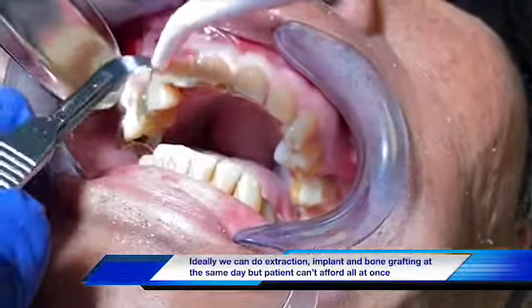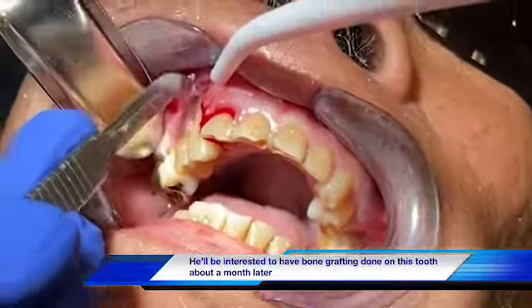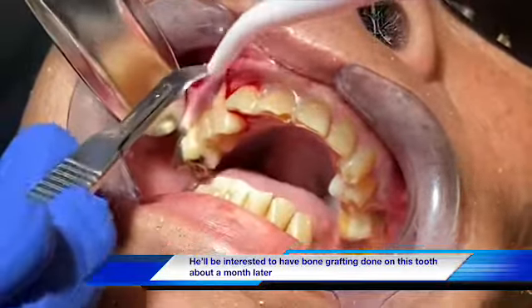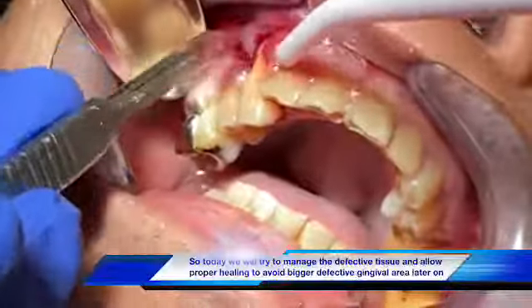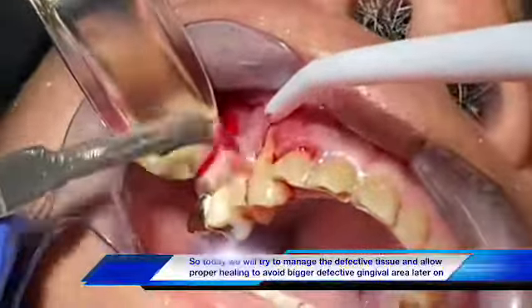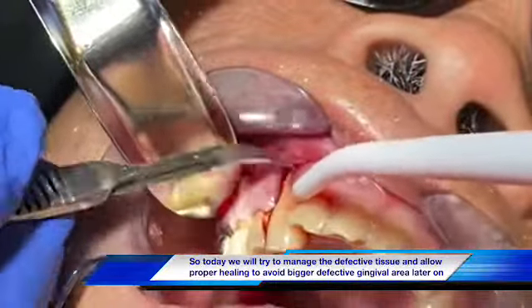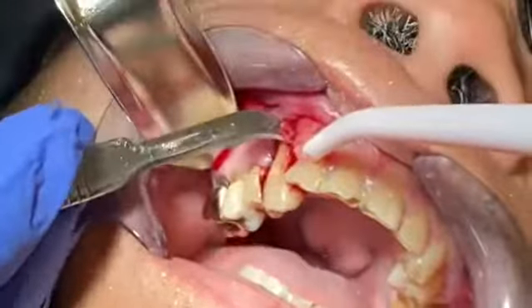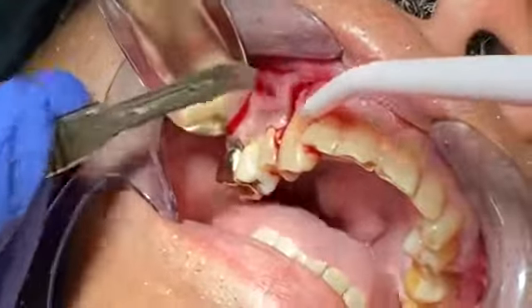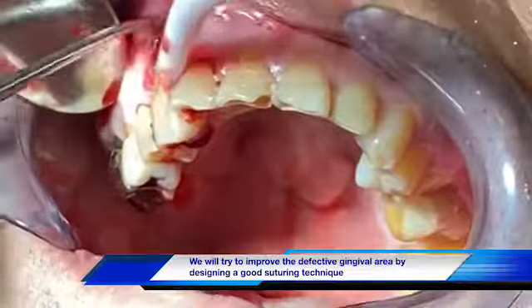Now in this case, the patient cannot afford an implant or immediate bone graft, but he will do it within the month from now. So what I will do is try to manage the gum in a way that by the end of the next month's appointment, or a few weeks from now, the gum will not be severely receded before we have to fix the defect area.